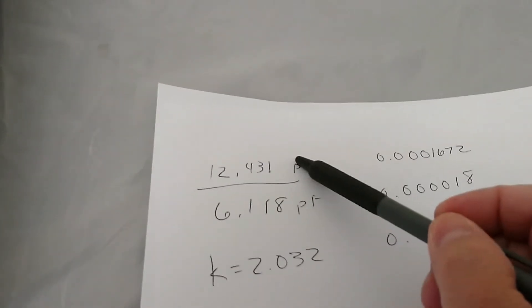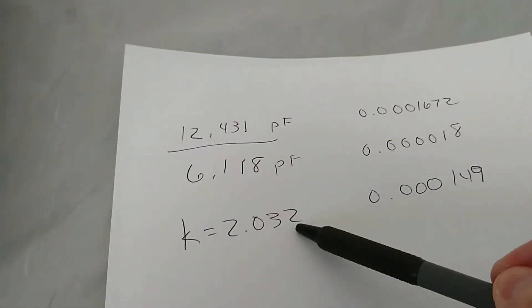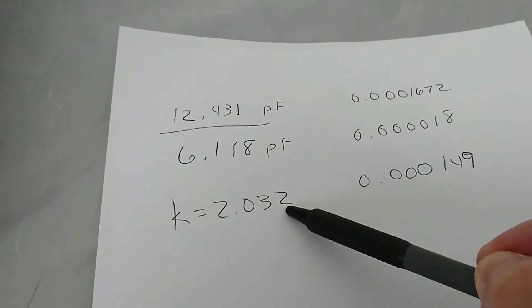At this point, we can basically take the capacitance we measured with the sample, divide it by the capacitance in air. That gives us a dielectric constant of 2.032.